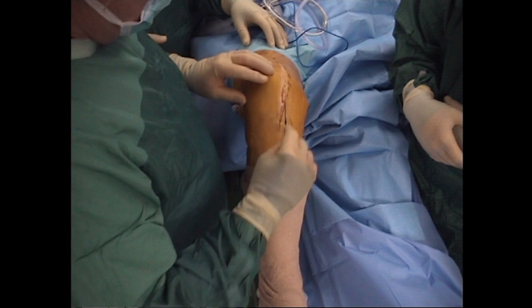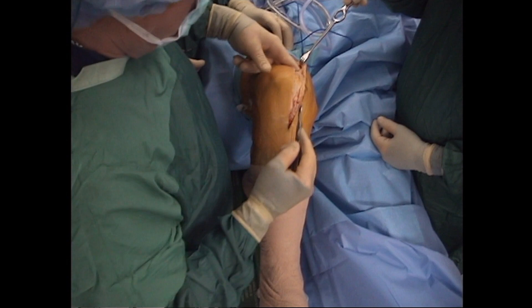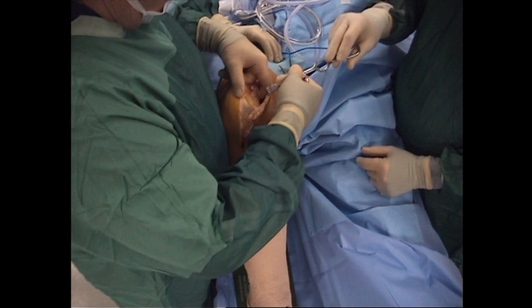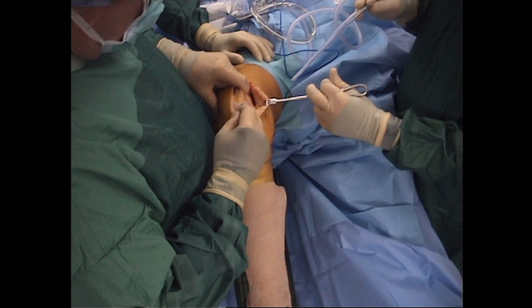Begin by making a slightly curvilinear incision so as to avoid an incision directly over the apex of the patella or the tibial tubercle. Today we'll be doing a sub-vastus exposure. Sharp dissection is taken down to the level of the vastus fascia. A tonsil clamp is then used to identify the intermuscular septum, and the body of the vastus medialis is then reflected laterally. The arthrotomy is then completed at a 90 degree horizontal to the patella and down inferiorly.